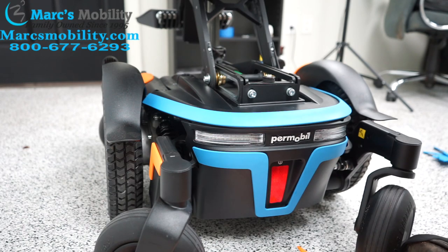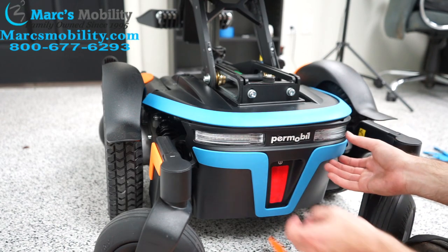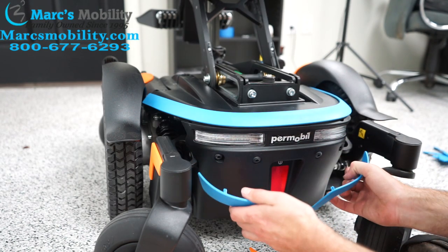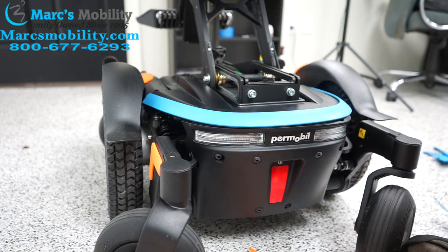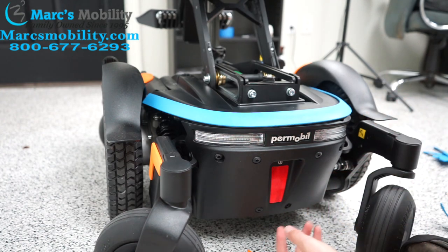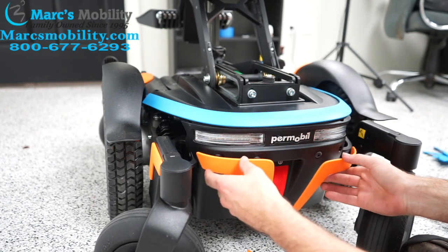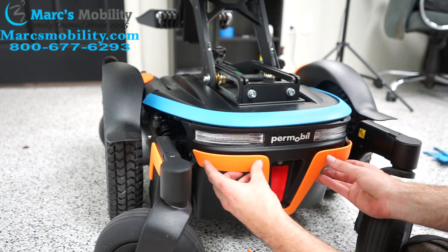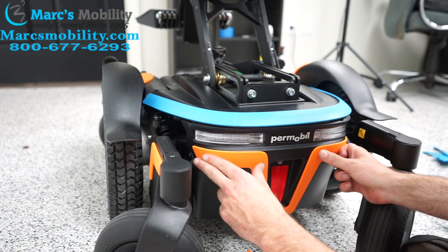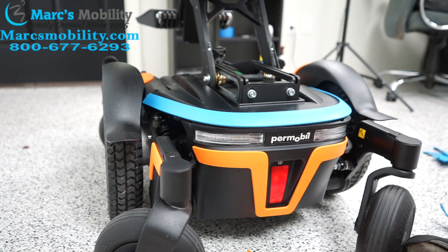Now we're on to the last part: the rear shrouds. I'm going to start with this bottom piece. Just like most of the chair, it just kind of pops out. And then the new shroud will just pop in. Unfortunately on this chair, whoever owned it previously, one of the little rubber stoppers is out, so it's not going to go completely in — you might run into that when changing your chair. But it will still fit pretty well. So these four go in, this one goes in, and it's just going to kind of sit like that.